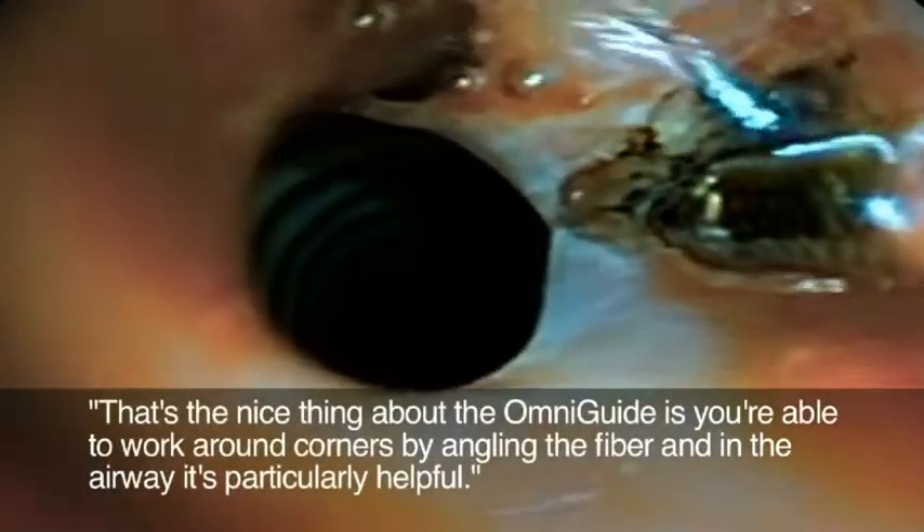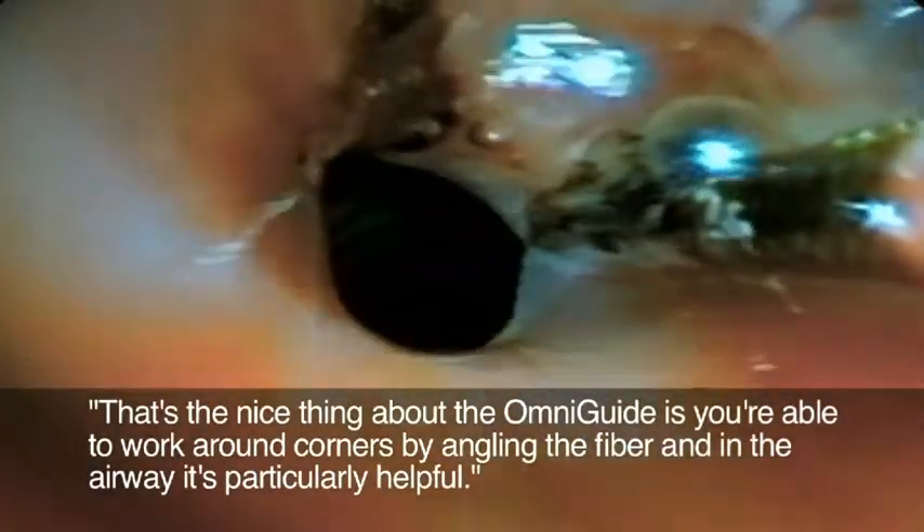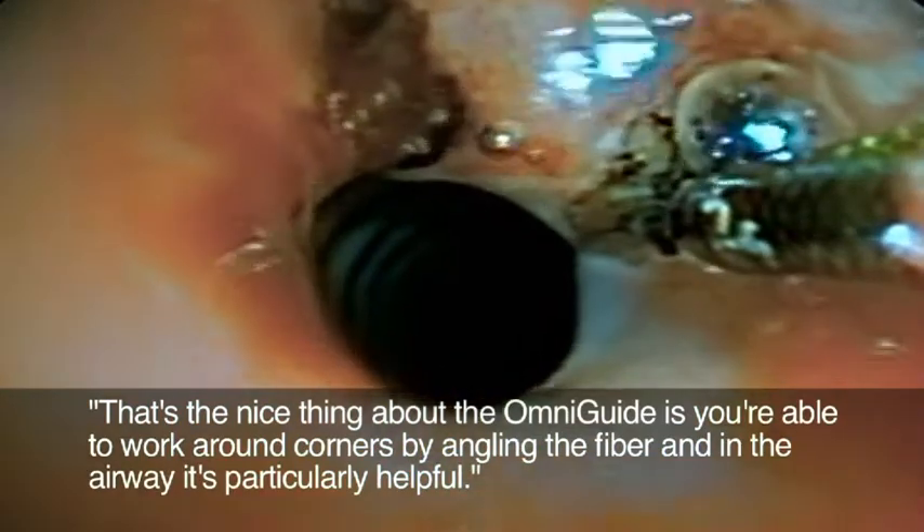The first laser I used, beginning about 17 years ago, was a CO2 laser. The only problem is the micromanipulator we use to aim the beam is sometimes difficult to use in tight quarters. And that's the nice thing about the OmniGuide — you're able to work around corners by angling the fiber.